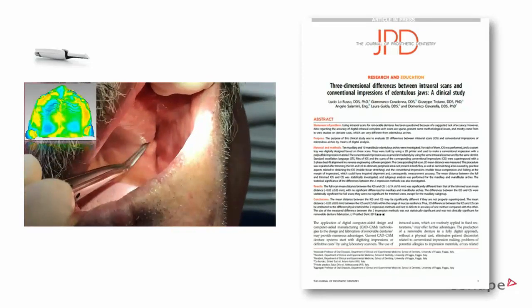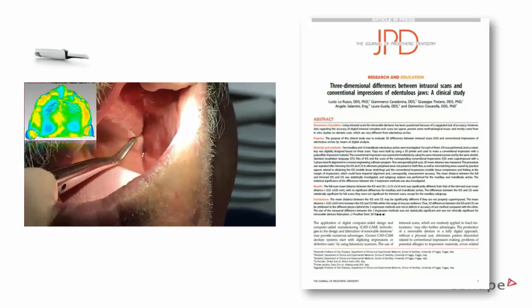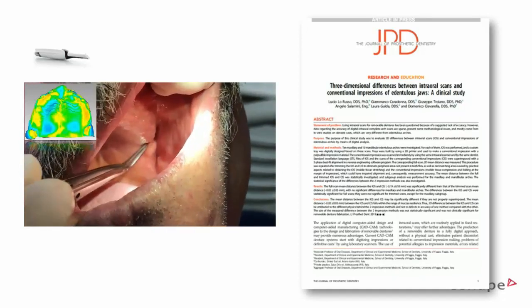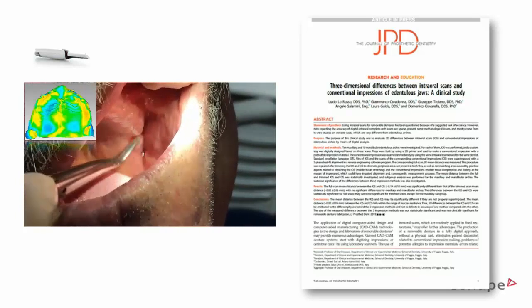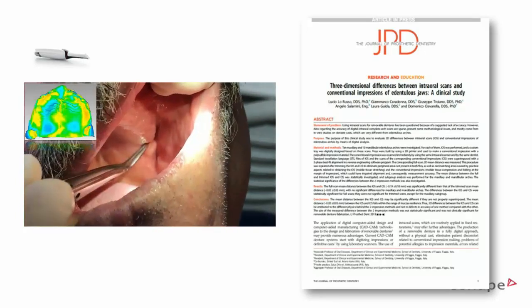Yeah, so there's a range of different opportunities here. It depends whether it's for an immediate denture, it depends whether he has an existing denture, or it depends whether he's fully edentulous. And the reality is that they will often have either an immediate denture, or they will need an immediate denture where they have a bite, or we will be able to do the copy denture workflow.